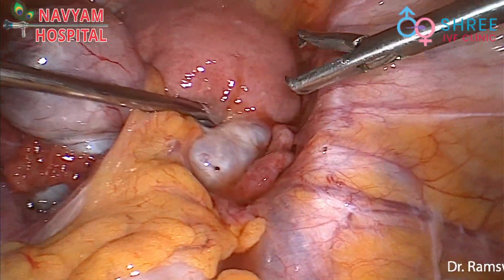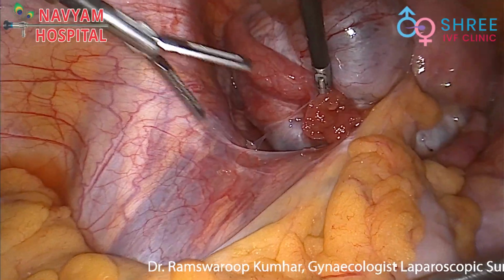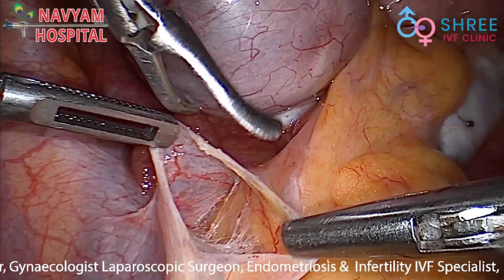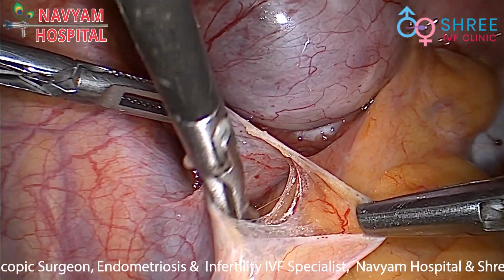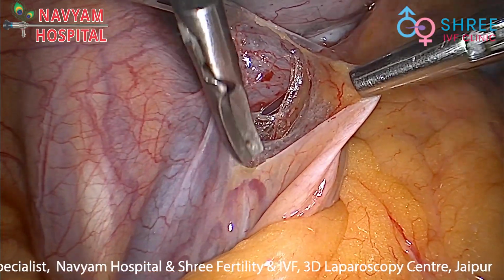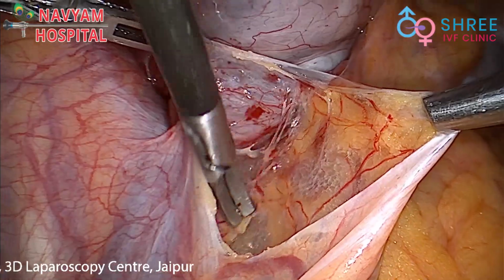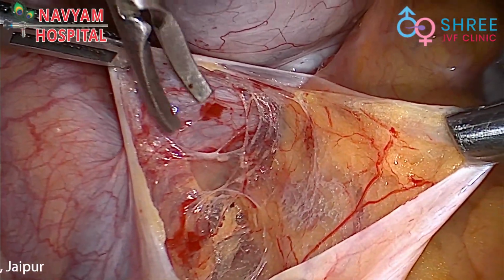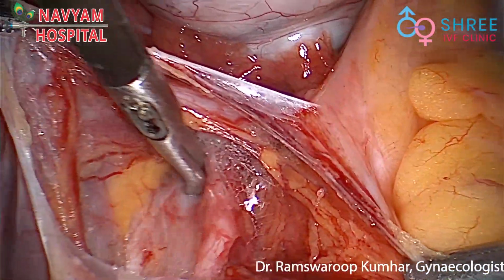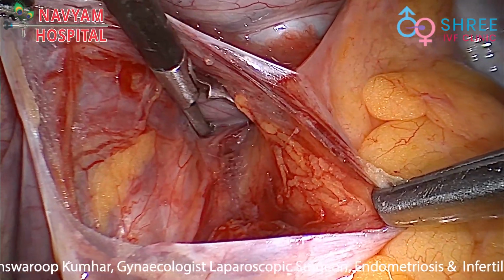This was the initial endoscopic view of the pelvis. For the TLH and BSO, our first standard step is sigmoid mobilization and dissection at the brim to identify the ureter and the surrounding structures. As usual, we start the dissection from a virgin plane, and it's almost always from the brim. We identified here the left ureter, and further dissection was carried out to dissect the ureter deep.